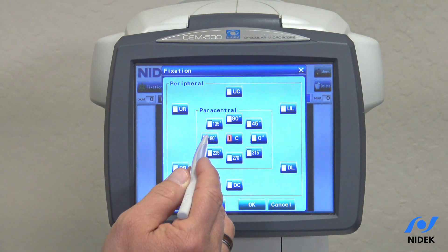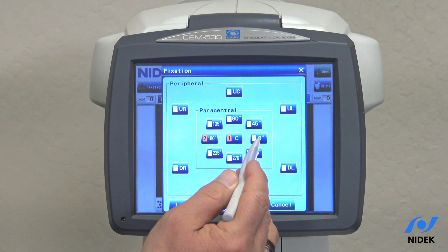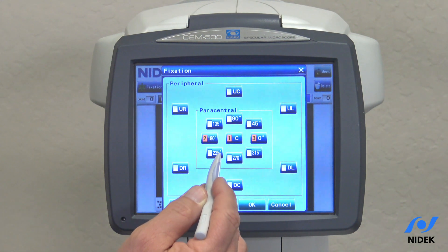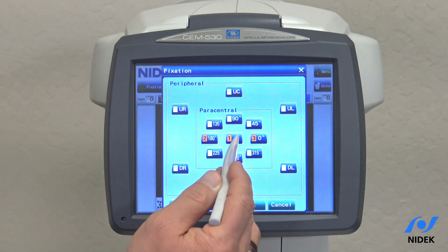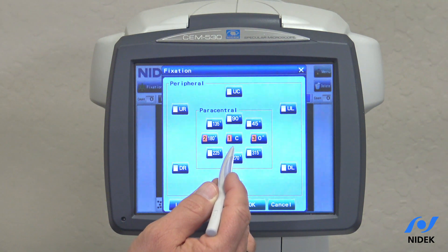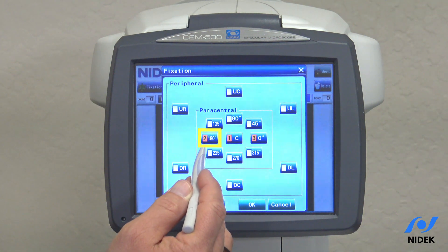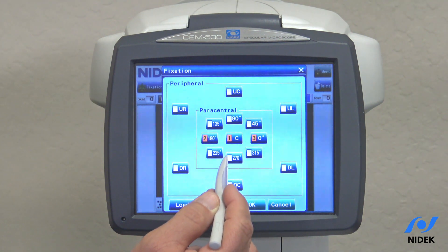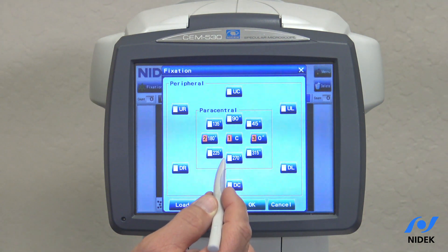You can customize the area that you would like to capture. For example, if you would like to take three images — two paracentral and one central — the Specular Microscope will take one, move to two, and take three. It automatically captures.